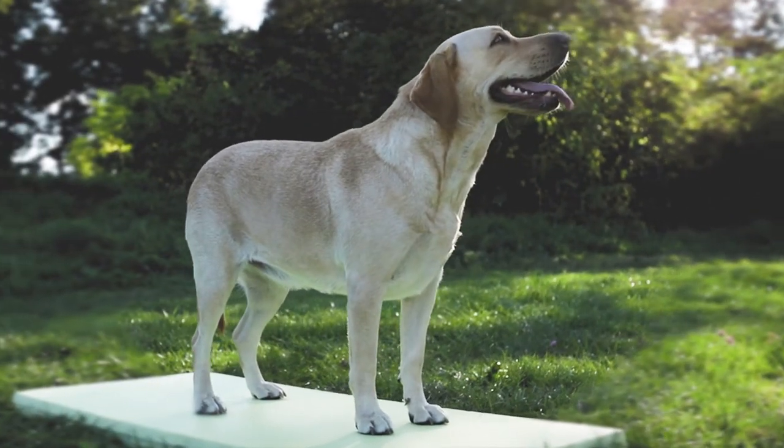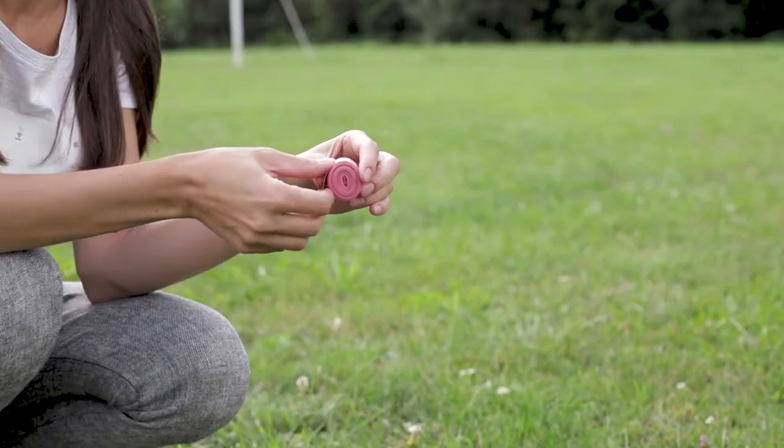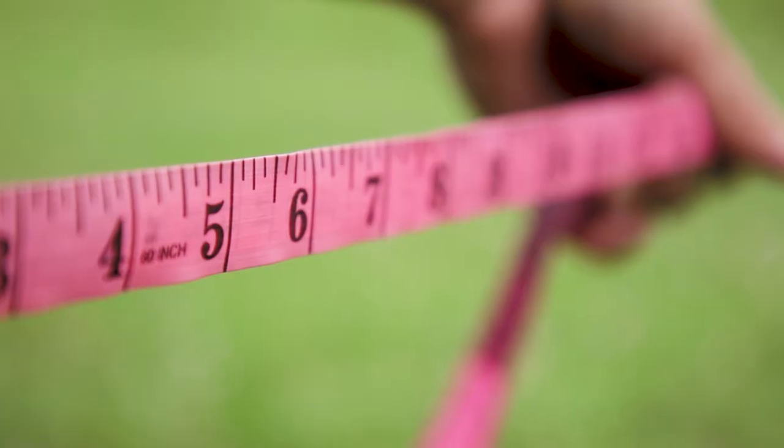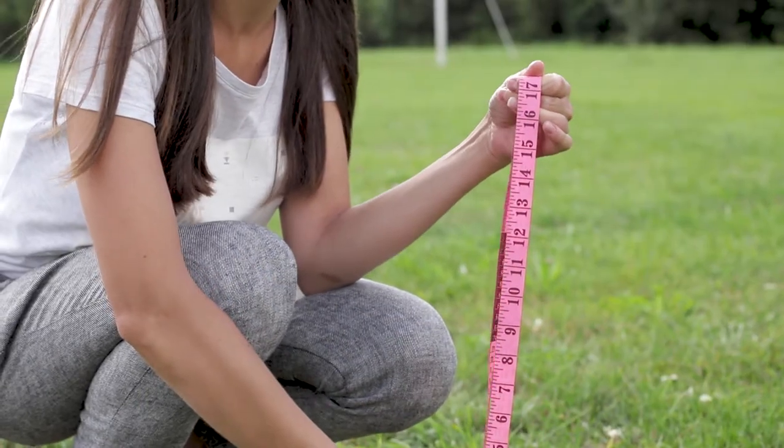All measurements should be taken with your dog standing. We recommend using a soft measuring tape. If you don't have one of these on hand, use a piece of string and then measure the string with a ruler.